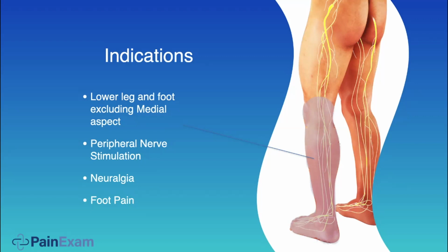If you do a sciatic nerve block in the emergency room with dexamethasone 4 milligrams, 4 mLs normal saline, and 4 mLs quarter percent bupivacaine, and you do it right, there is a very good chance you will alleviate the symptoms, possibly temporarily or for the long term. I've seen sciatic nerve blocks last months. I've seen them be curative. I've seen them last an hour. So there's a huge variety, but in the ER you'll get that patient out and refer them to a pain doctor who will then take over. That would be the best thing.